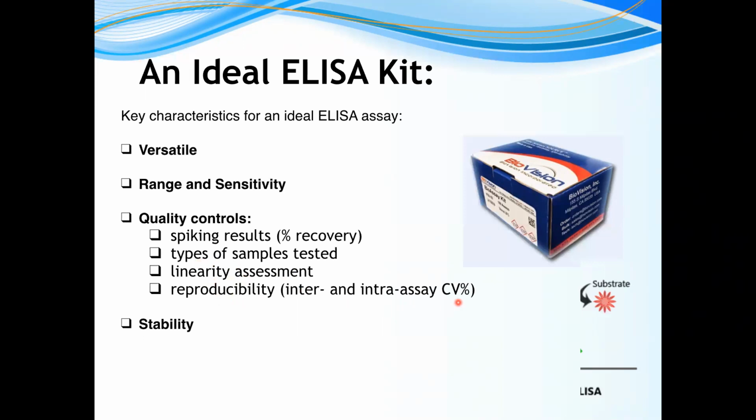As a range of ELISA brands is available in the market, it is important to ensure ELISA test quality by checking the quality control performed by the supplier.